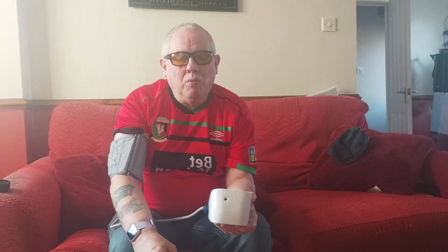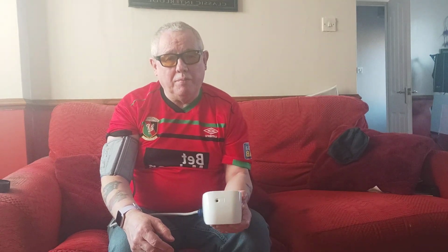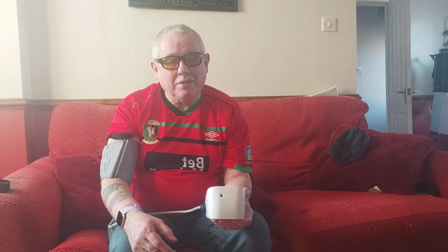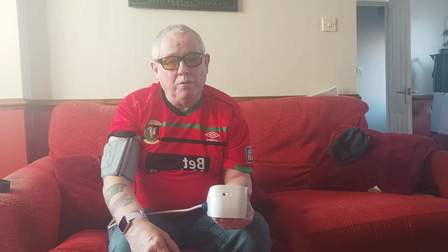But one thing I want to say, and even the doctor said, do not worry about what your blood pressure is in the morning, because come lunchtime my blood pressure probably will be back down to 120 over 80. I've only just taken my medication, so it hasn't really kicked in yet, and in the morning your blood pressure would be high. I probably wouldn't recommend taking your blood pressure first thing in the morning. I would take it at lunchtime, dinner time, and just before you go to bed.